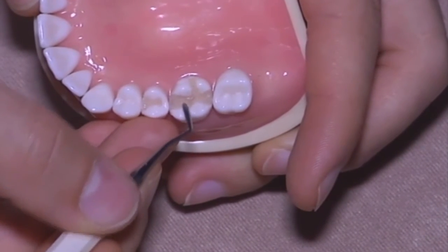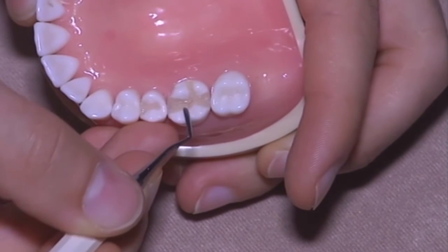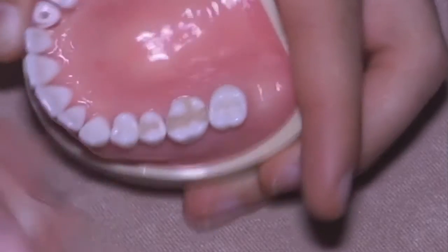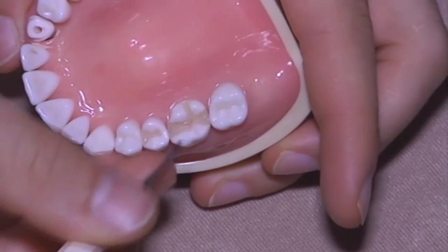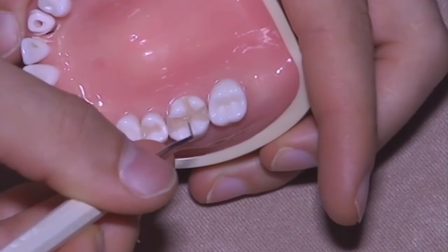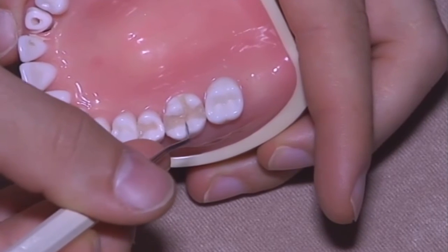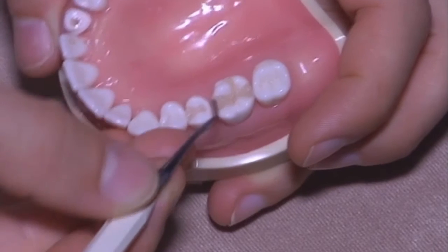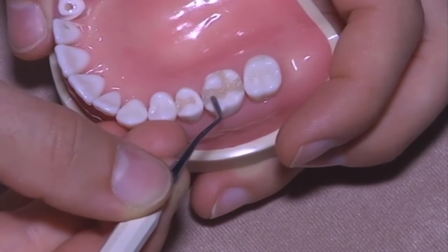Following the triangular inclination, crest inclination, approaching the composite toward the center of the restoration. Designing the anatomy.